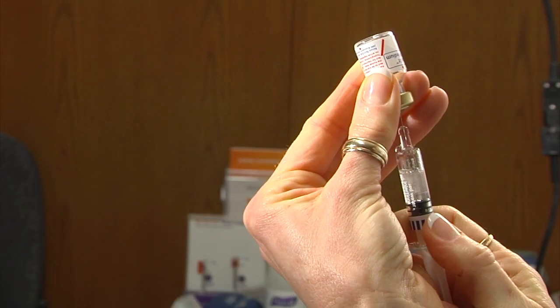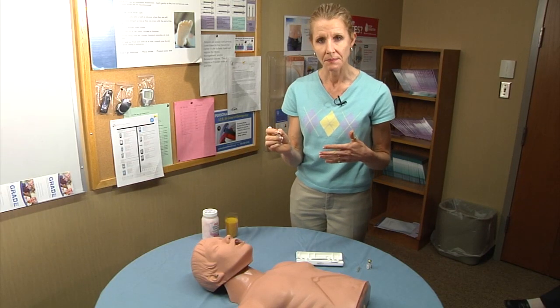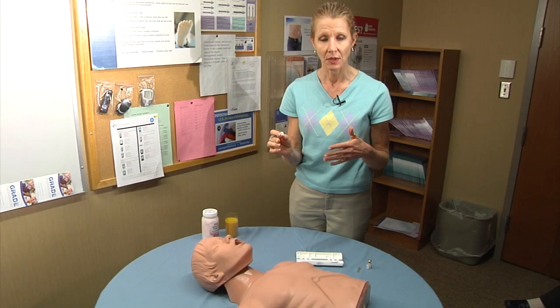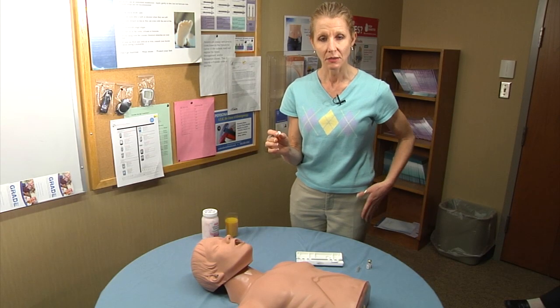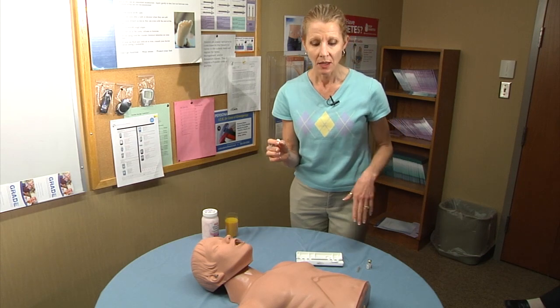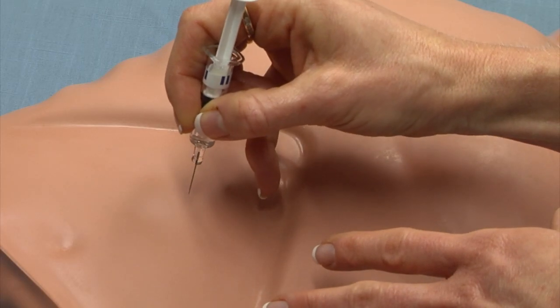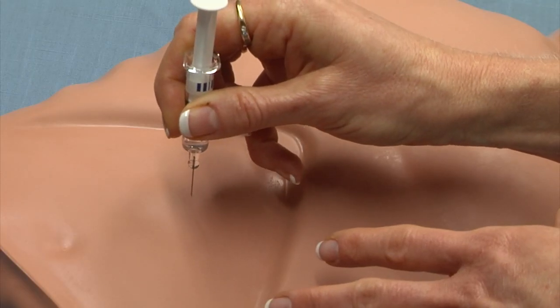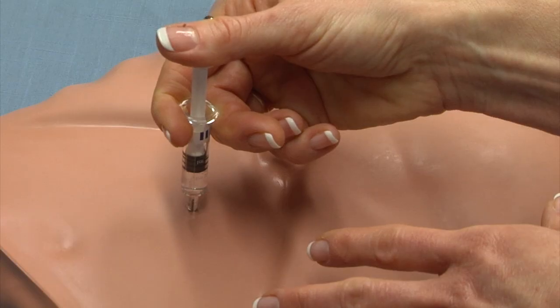Then you're ready to give it. Hold your syringe like a writing pen or a dart, and you would give the glucagon in any place that you can give insulin, which would be the abdomen, the thighs, the arms, or the buttocks. You want to go at a 90-degree angle into the skin, inject the entire amount of medication, and then take it out.